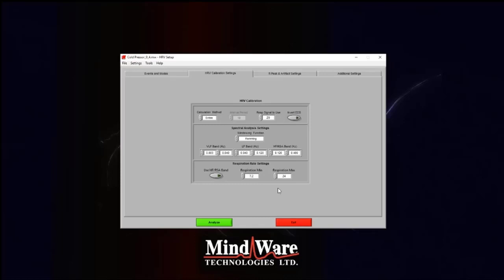If we look at a much smaller amount of time, such as 15 seconds, we're certainly not going to get up to those 24 respirations, unless we're looking at somebody we expect to be breathing really rapidly, on a treadmill or an infant. There are certainly studies where I've seen RSA published with less than 30 seconds, but it's one of those kind of states.